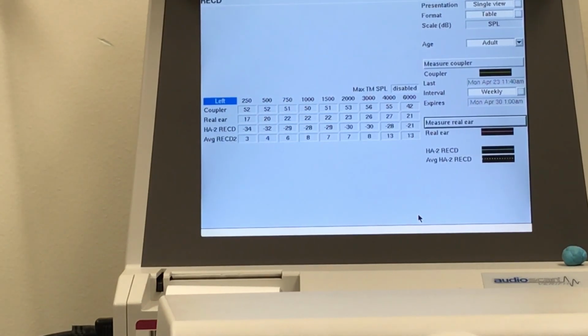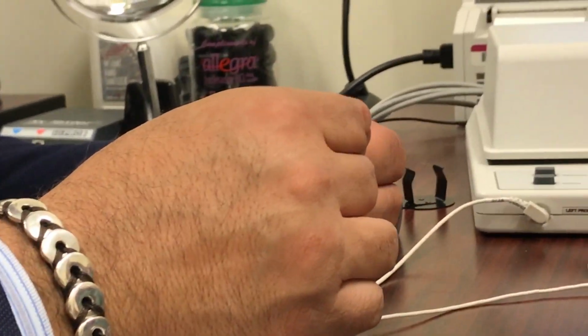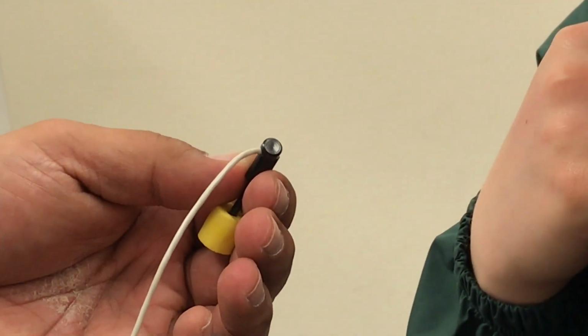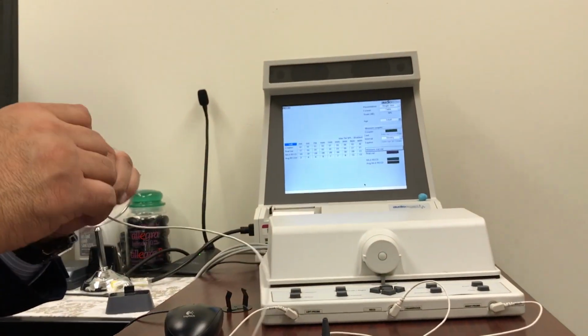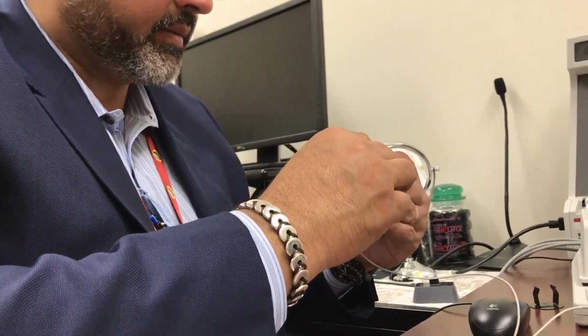And I'm wondering if this isn't torn. I can't see this, but this looks like it's torn. Take a look at that. Do you see the same thing? Or is it just my eyes? This thing is eventually going to come up. There should be another one of these. Let's try this again. Let's try this again. Because it's not supposed to be that off.